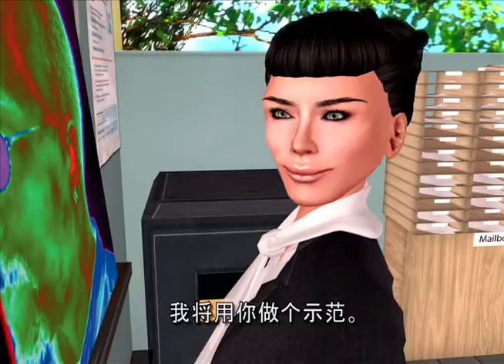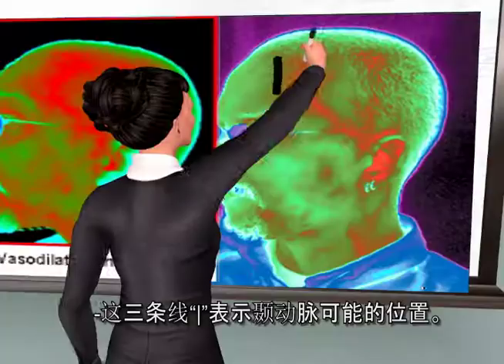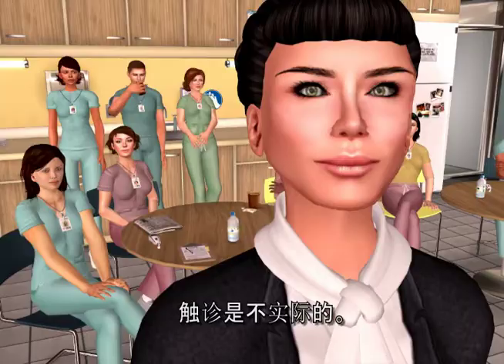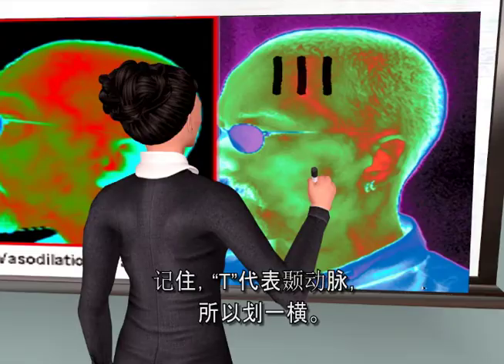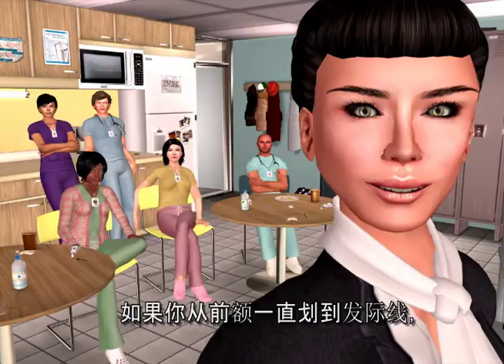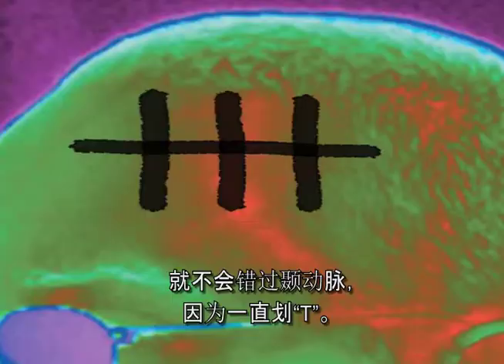The three lines indicate where the temporal artery might be. We can't actually see it since we don't have infrared eyes, and palpating is impractical. Think T for temporal artery and cross the T's. If you can scan all the way across the forehead into the hairline, you cannot miss the artery, and you will always cross the T.